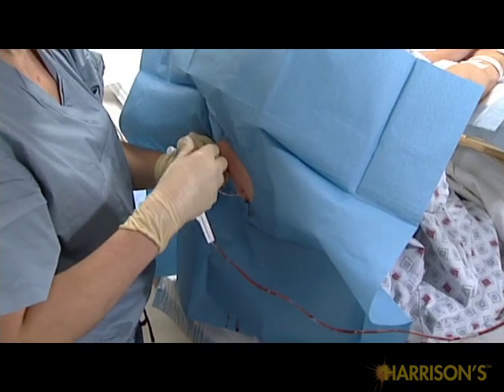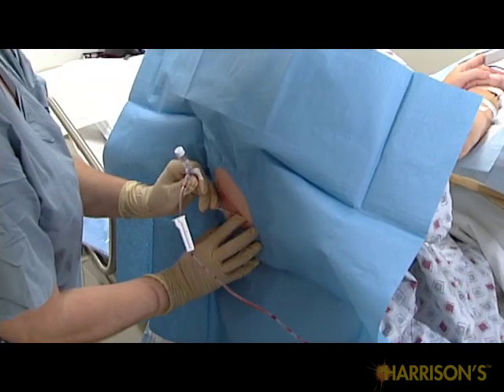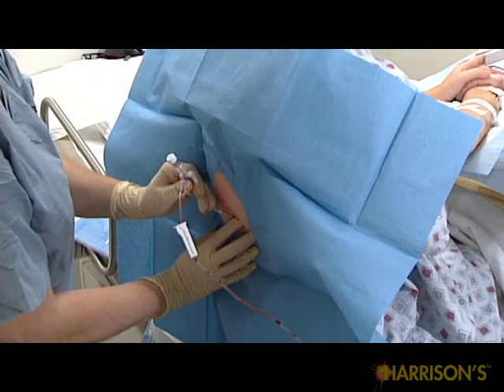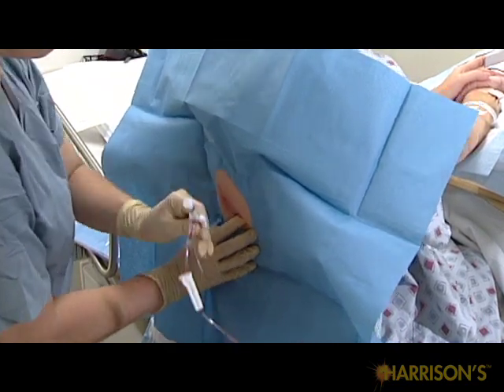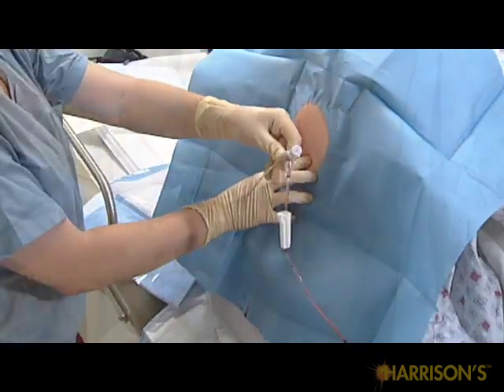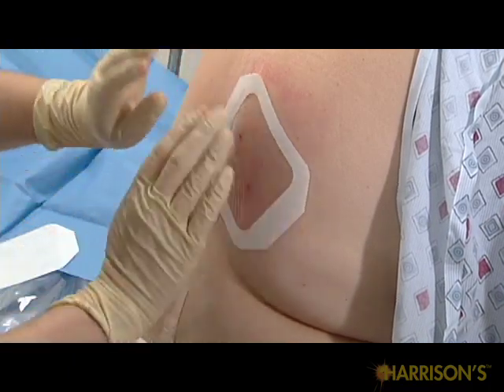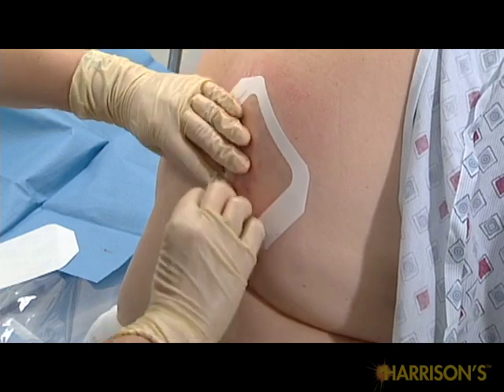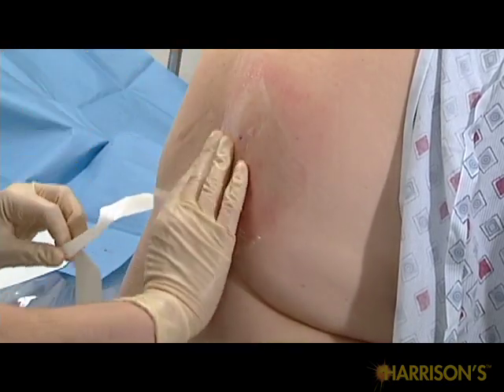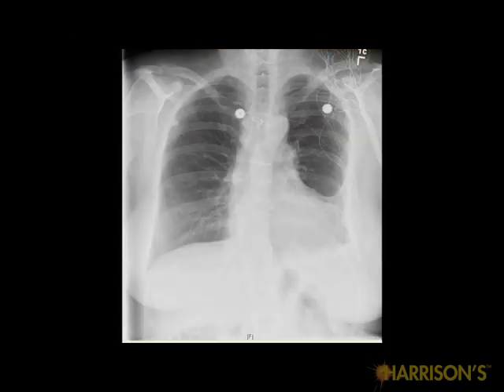When the procedure is complete, turn the stopcock with the off position facing the patient and have the patient take a deep breath and perform a Valsalva maneuver. Have a sterile gauze and occlusive dressing ready for placement as you remove the needle and seal the puncture site swiftly but carefully. Obtain a chest X-ray to evaluate for adequate drainage and to rule out pneumothorax.